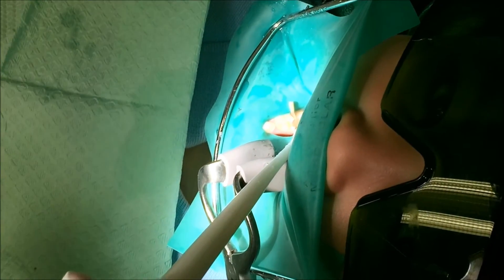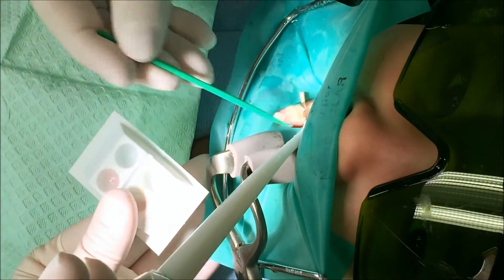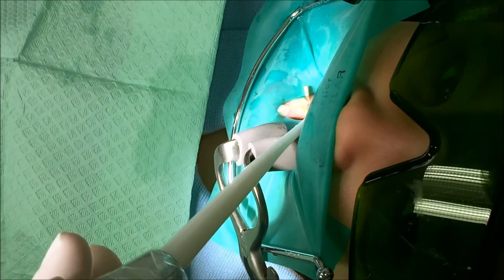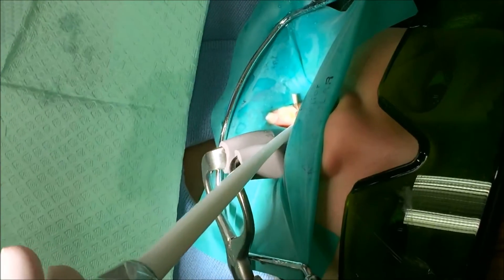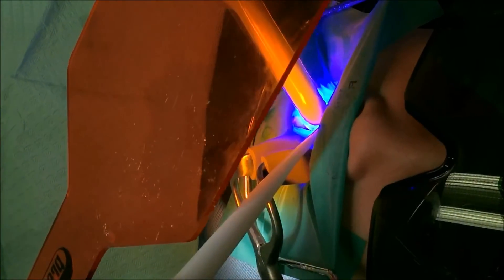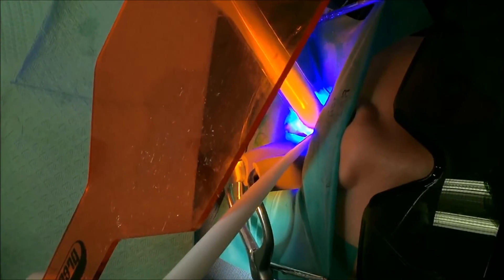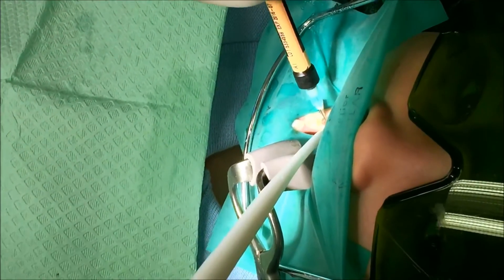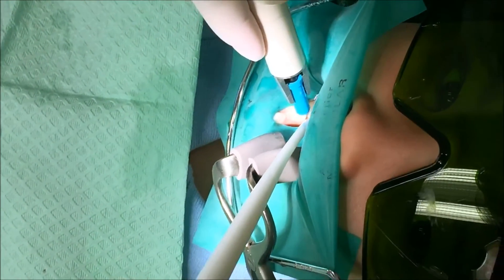I'm going to put some conditioner on. I'm going to put a flashlight on this to dry up the conditioner. I'm going to put the filling in — just to wrap up the filling here, Jada. You are awesome.